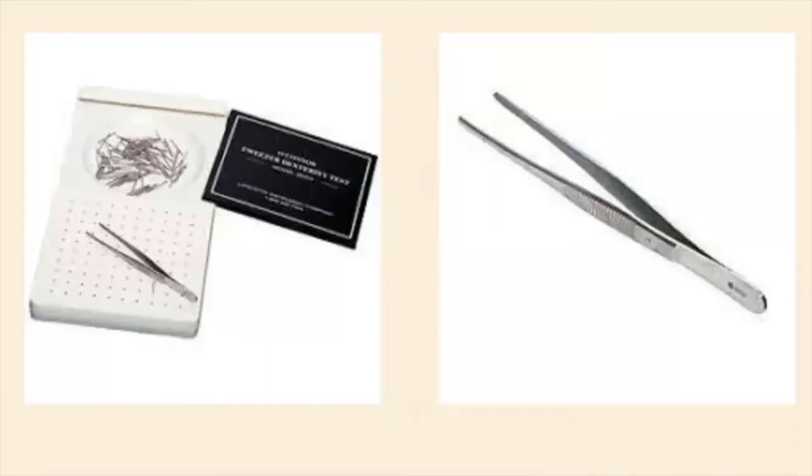Here are just some pictures. On the left is the assessment itself — it's small and portable. On the right I included a picture of the tweezers, just to show that you can't use any pair of tweezers you have lying around your house. There's a specific pair that you have to use for this assessment.